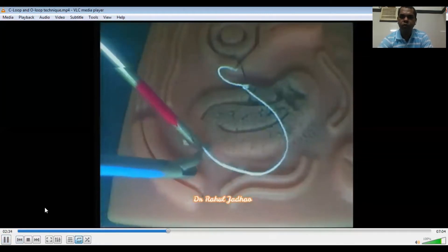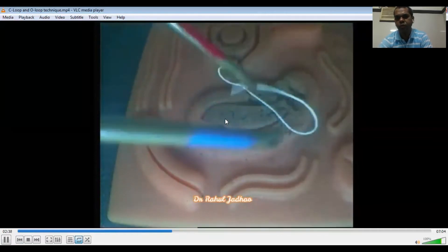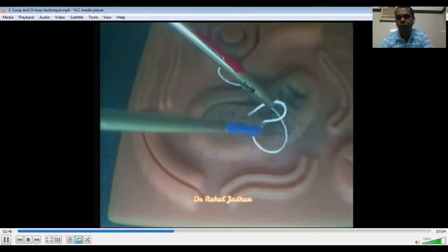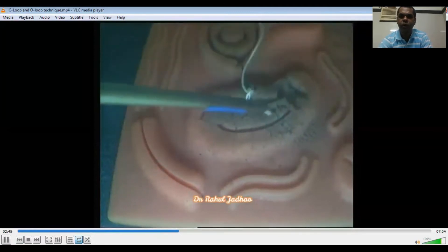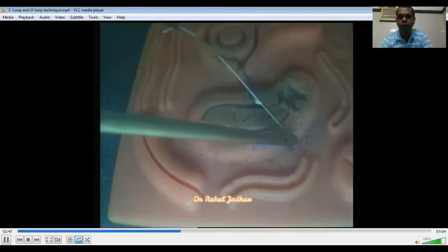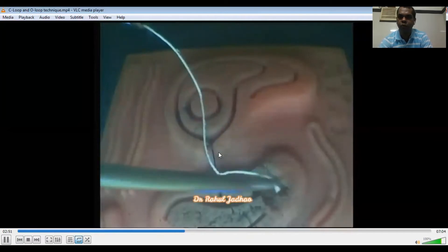Now the C is facing to the left, so the left needle holder is holding the C-loop. The left hand will supinate, loop is made, and the right needle holder will go inside. This is the C-loop technique. We should not pull incorrectly.